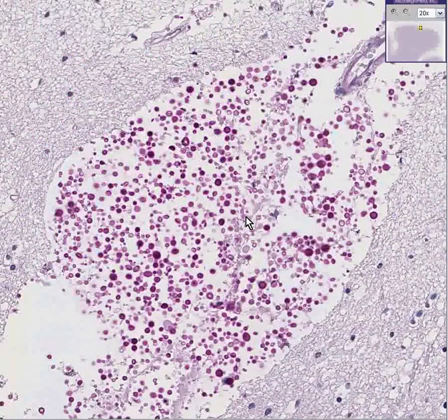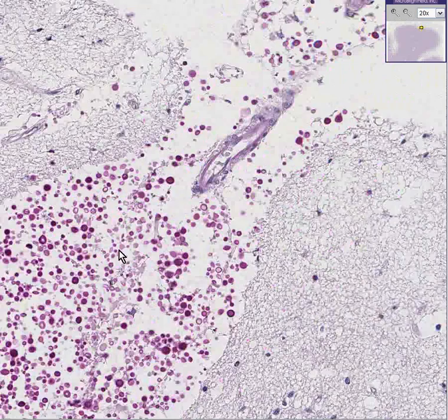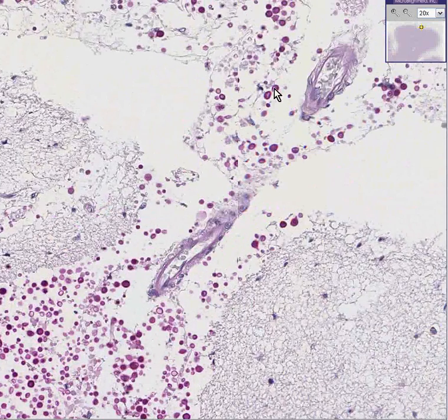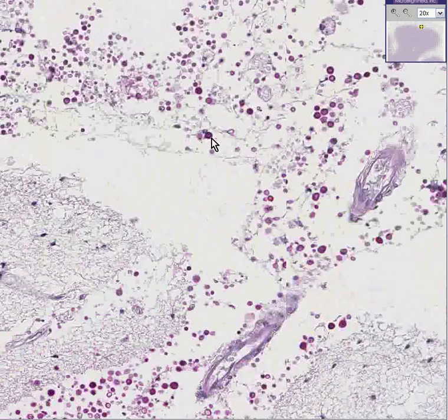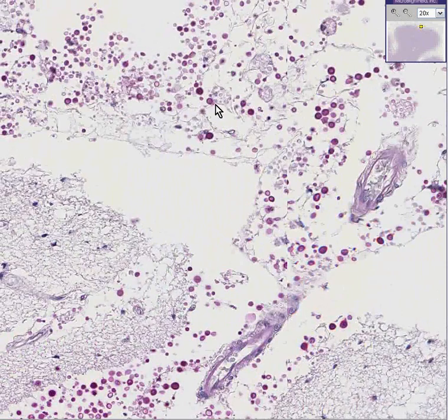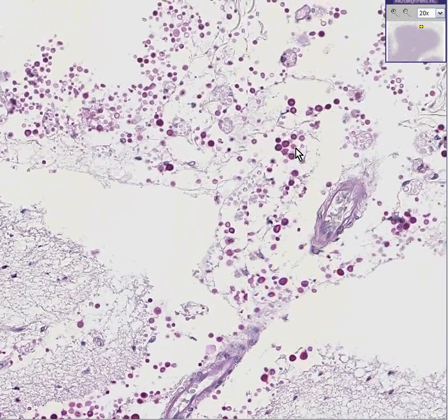But when these patients come in and they're sick, they may be curable, because if you do a lumbar puncture, which would be very rich in these little organisms, and then you put them into a regular old saline solution that has India ink on it, these little yeast forms produce a big white zone within the middle of the India ink, and they have a characteristic appearance, even if they have a bud.